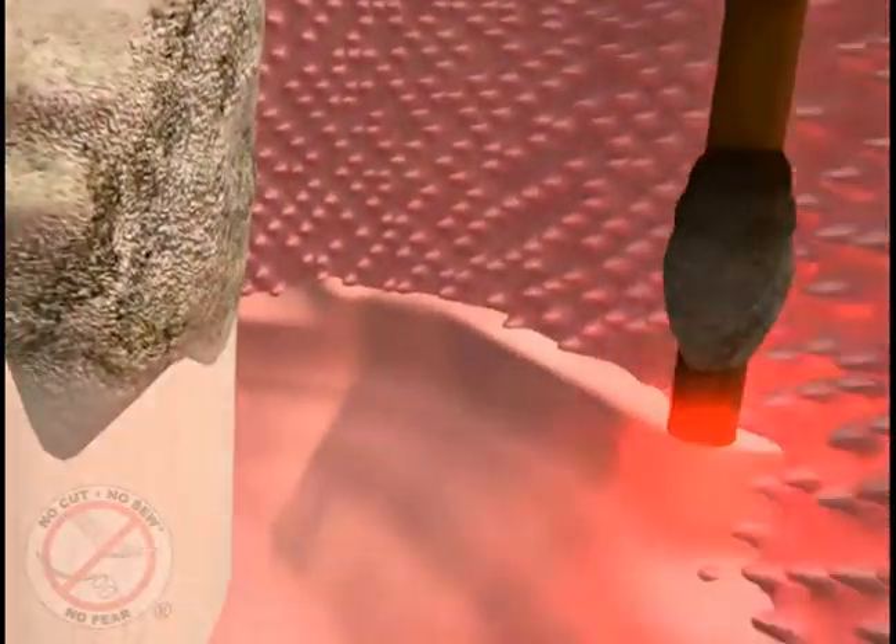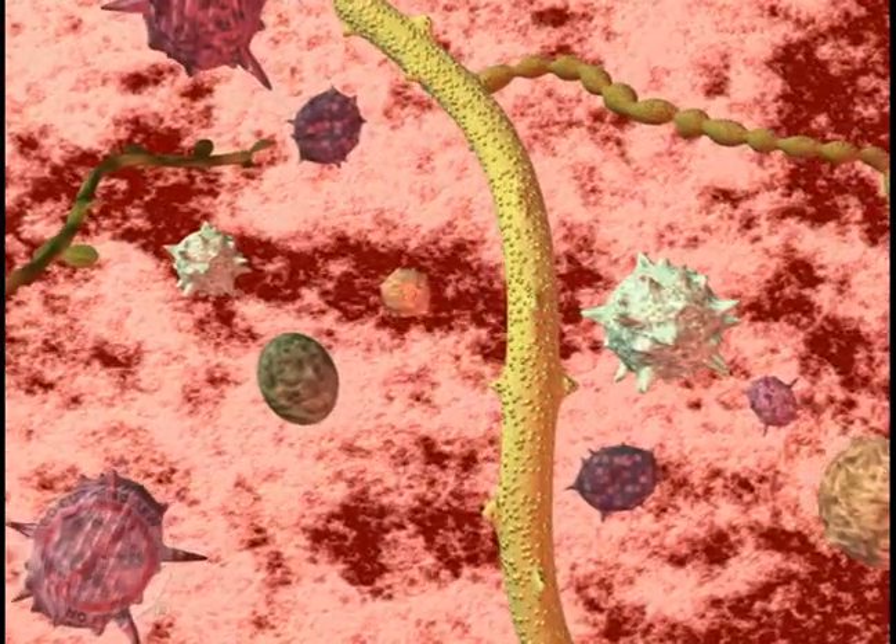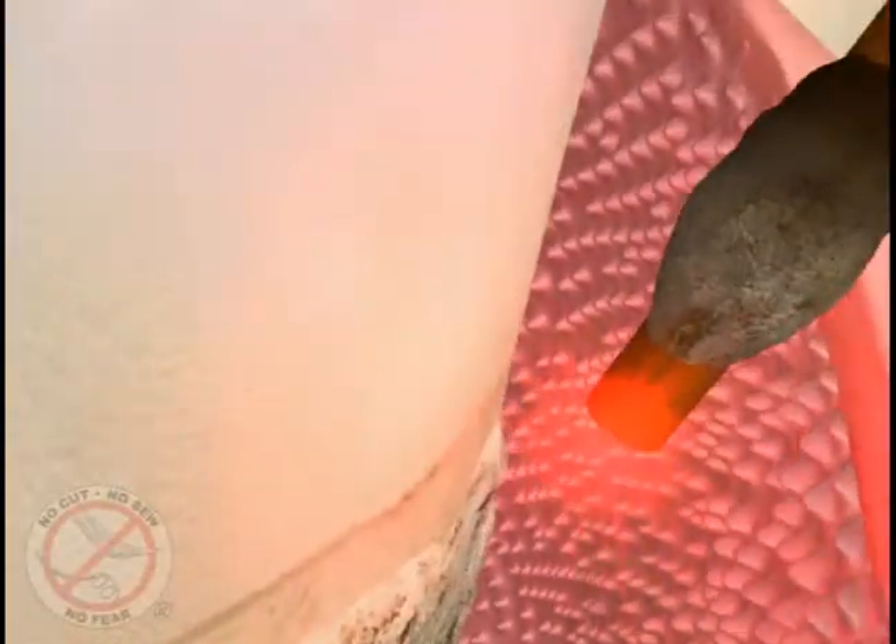There are specific germs and bacteria that cause gum disease. The Periolase laser is designed to target and eliminate selectively only the diseased tissue and germs, dissolving toxins and leaving the healthy tissue unharmed.